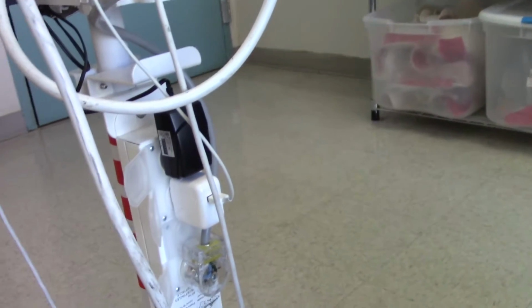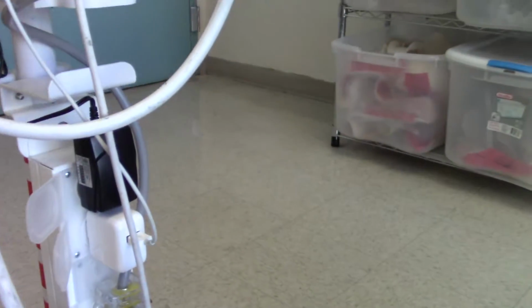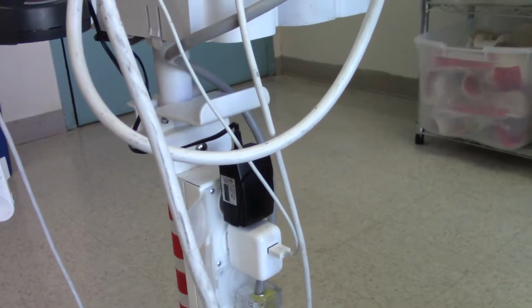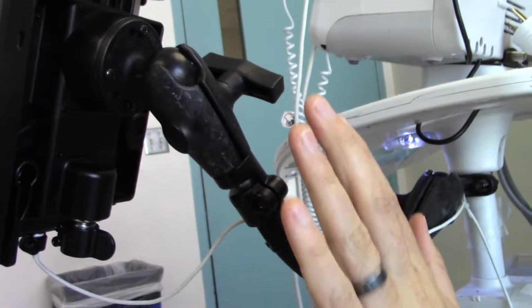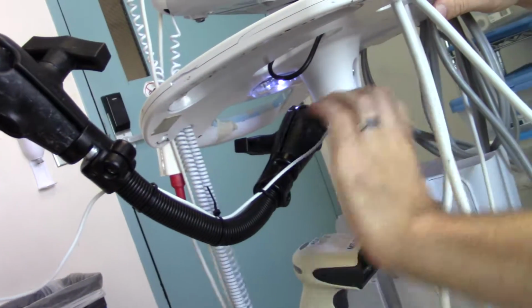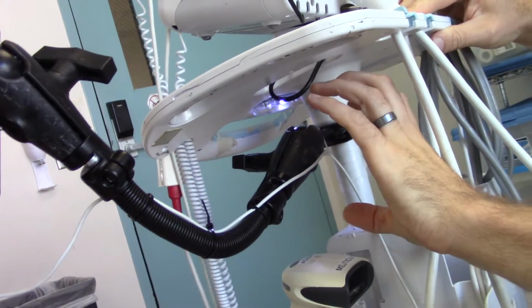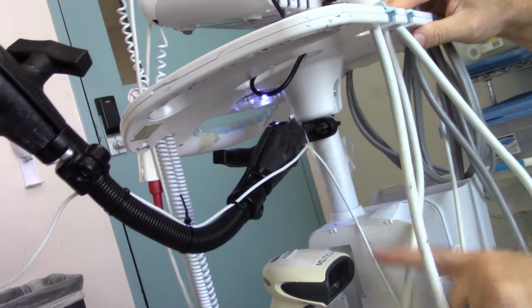Okay. So it seems like if there was some way to put a little snap-on cage that secured these and protected the cables, that would be a big help. Or even just a piece of aluminum bracket that held the iPad in place, mounted as a rigid unit, with your charging devices locked and secured underneath here. Something like that would be great, and then maybe just one little power cable.